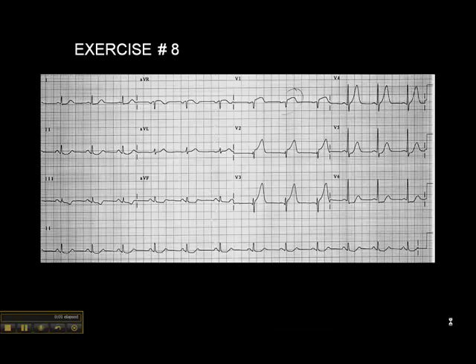Now we're on exercise number eight, and again we'll go from left to right. There's no ST elevation in lead two, lead three, or AVF.